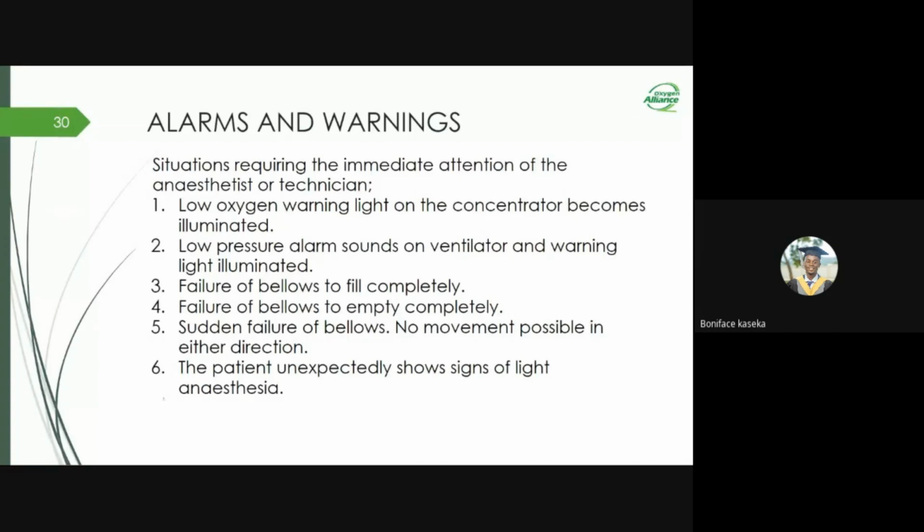Now, moving forward to alarms or situations that will require immediate attention of the anesthetist or technicians, we can have a condition whereby the low oxygen warning light on the concentrator starts to illuminate. This many times happens when a filter is obstructed, and also many times it is due to degraded zeolite in the sieve beds. To solve this problem, we just change the filter, wash it, and replace it back. And for the zeolite problems, it means we need to replace the sieve bed with new functioning zeolite.